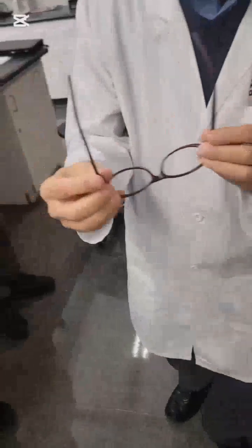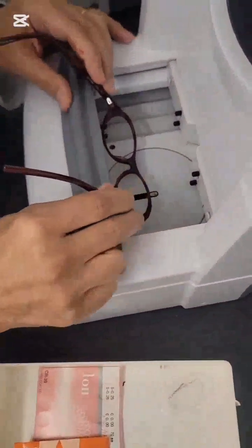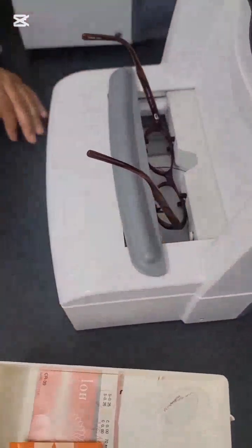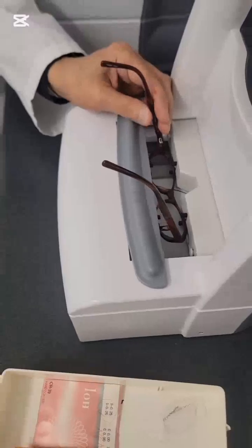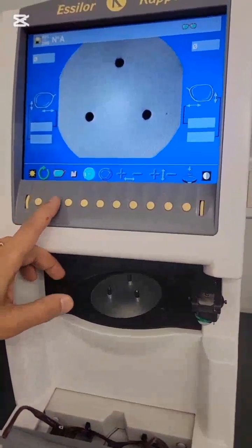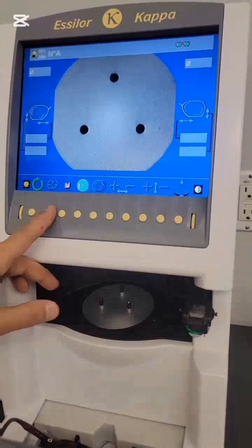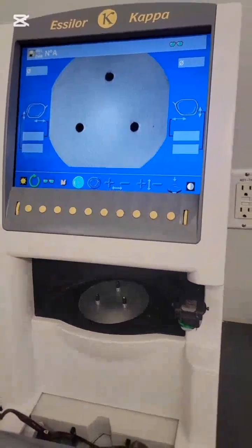We will now use tracer to trace the frame measurements. The temples of the frame should be towards you. There are 4 pins. Make sure the frame sits properly and bridge of the frame aligns with the center. Use this button to change the lens either right, left, to different shapes, or both the lenses. Use the green arrow button to start tracing.